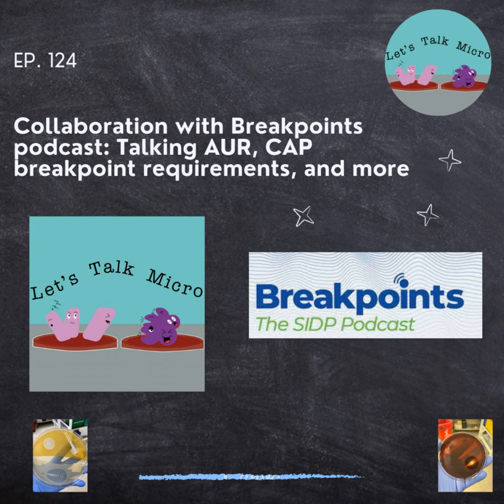Yeah, it's an ongoing challenge, and we don't have a solution for it at this point. We know that there are a lot of differences in what people test and how people test. And the other big challenge for us, of course, is that there are also differences in what's available for people to report. Are you getting this data pre-suppression, right off the machine where you have access to everything that was tested, or are you getting it post-suppression, where you're only getting it after all of your local manufacturer and local suppression rules have been applied?